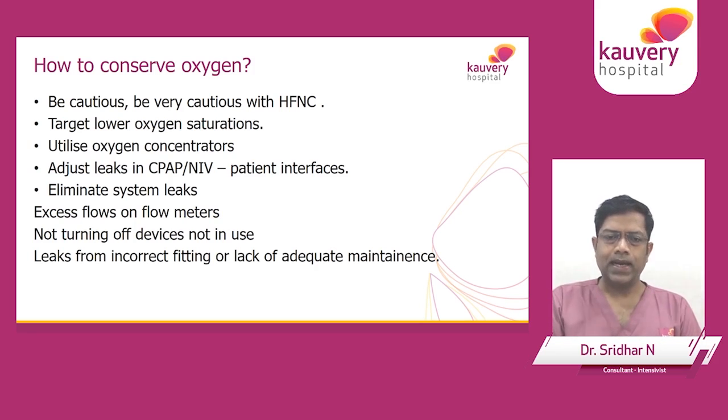Another thing I find is patients are on oxygen intermittently. So when the patient's oxygen devices are off, the oxygen flow meter is still on. So we must religiously turn off these oxygen flow meters. But we are not there all the time, so it's very much important to emphasize this to our nursing staff, to try and minimize oxygen use as much as we can.